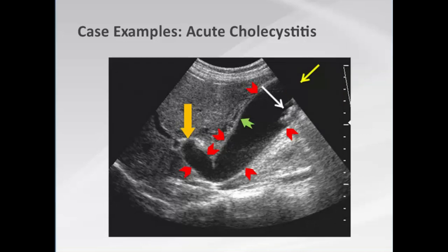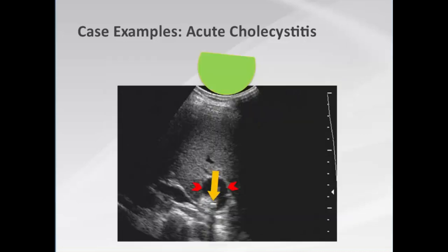Another patient with a very similar history: we see gallstones immediately, there was maximal tenderness over the sonographically localized gallbladder, the gallbladder is tensely distended, and there is gallbladder wall edema — a diagnosis of acute cholecystitis. With the patient in left posterior oblique, moving the probe intercostal, we unfold the gallbladder neck and cystic duct and demonstrate the obstructing stone, adding further confidence to the diagnosis.